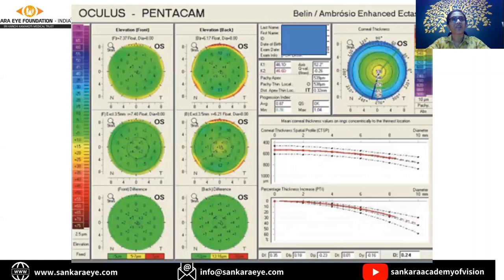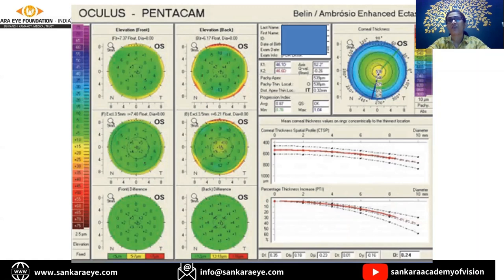The BAD display shows six pictures: the first shows anterior and posterior with the standard best fit sphere; the second shows results with the enhanced best fit sphere created from the patient's own cornea; and the last shows the difference between the two. Whenever the values show more than 12 microns difference, it indicates subtle ectatic disease or some curvature issue in this patient.